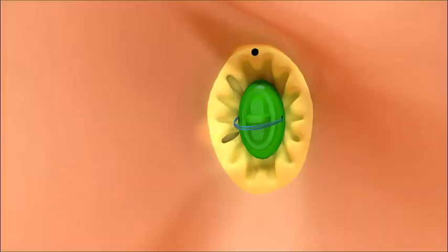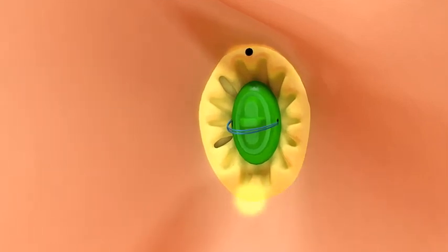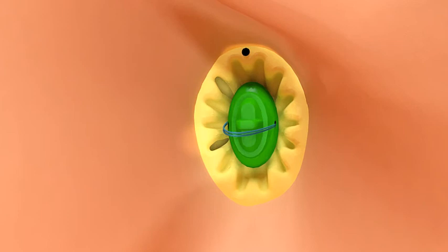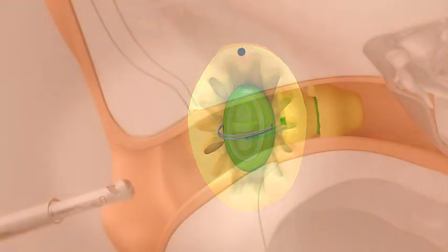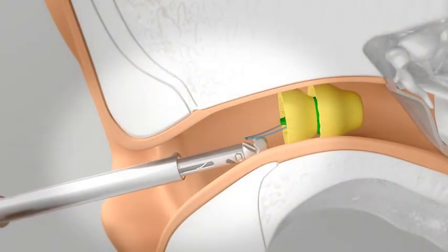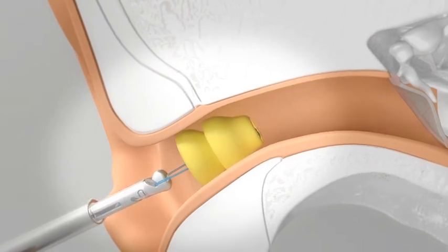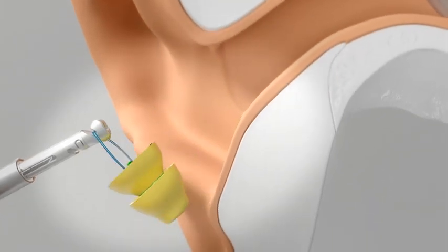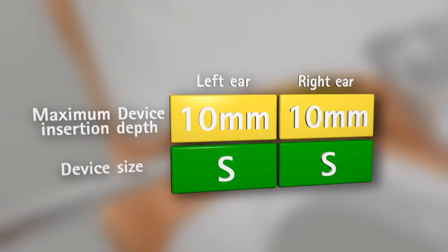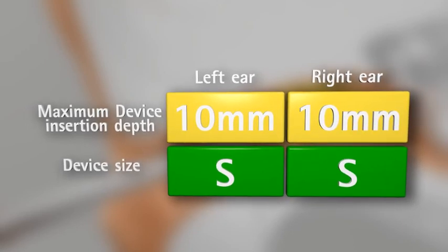The device size is correct when there are no gaps or folds and it fits comfortably in the ear canal. Record the correct size. In this case, the patient wears a small device. Remove the sizer from the patient's ear using the removal notch and repeat the entire sizing process on the other ear. The recorded measurements should indicate the maximum insertion depths and device sizes for both the left and right ears.